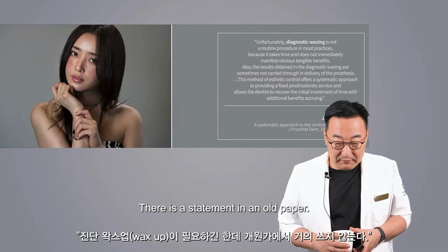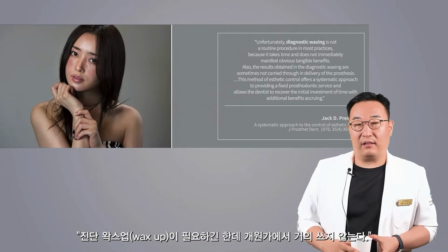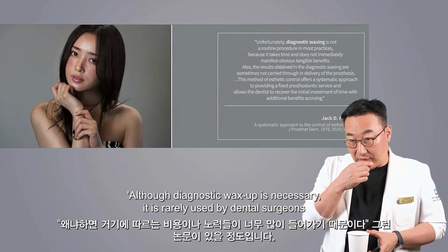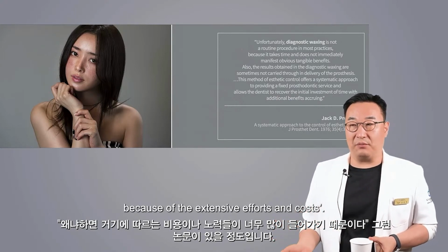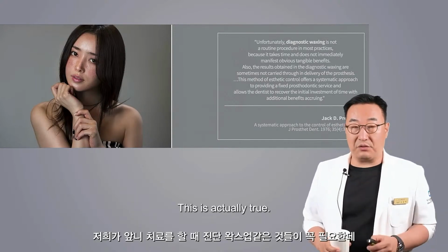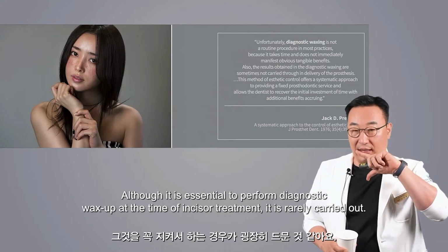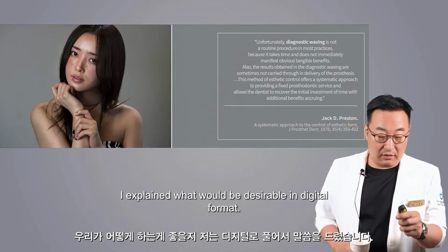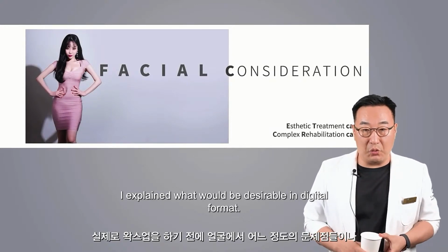There is a statement in an old paper. Although diagnostic wax-up is necessary, it is rarely used by dental surgeons because of the extensive efforts and costs. This is actually true. Although it is essential to perform diagnostic wax-up at the time of incisor treatment, it is rarely carried out. I explained what would be desirable in digital format.